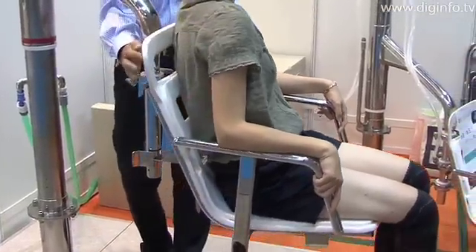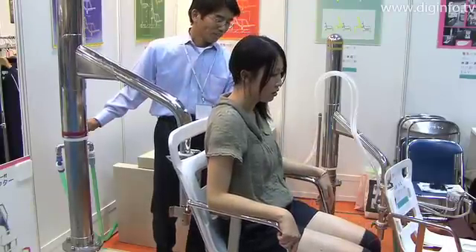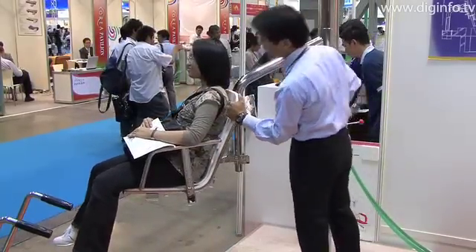Instead, patients can be bathed by merely operating the hydraulic pressure valve with the patient seated on the seat. The Universal Lifter rotates at 360 degrees, so the patient can be smoothly moved from the shower space to the bathtub.